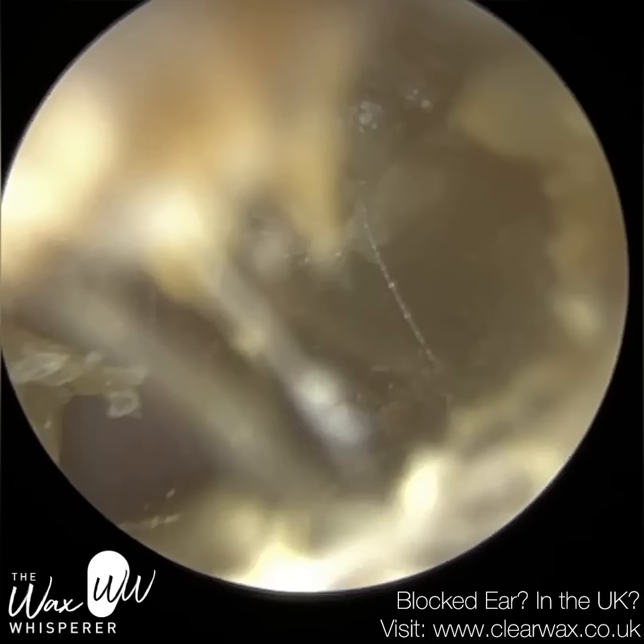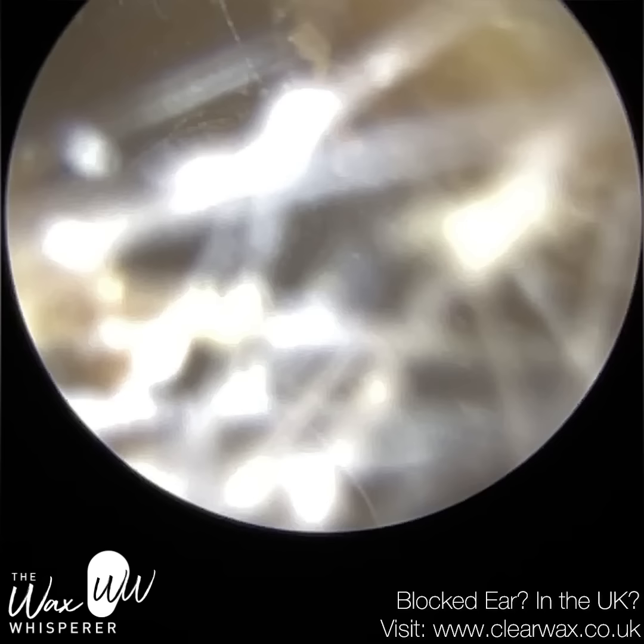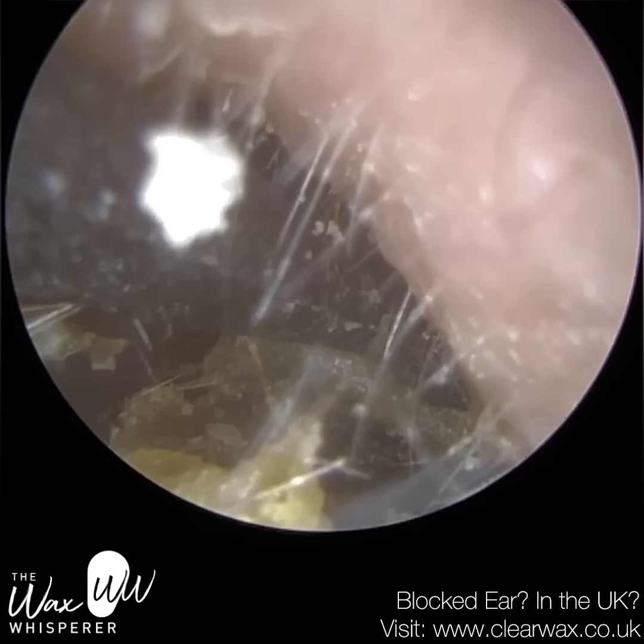The new Rycorret has several advantages compared to the previous Jobson horn that I used. The first advantage is that the end of the instrument is a lot thinner — it's more tapered. And that tapered end allows me to glide in between stubborn wax and dead skin that's compressed up against the canal wall.